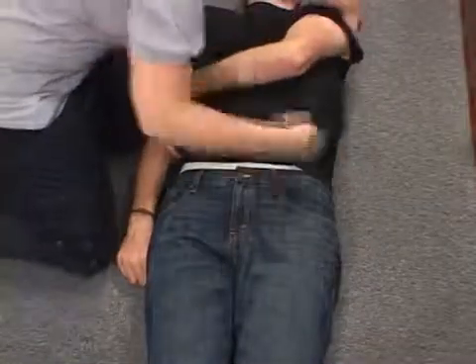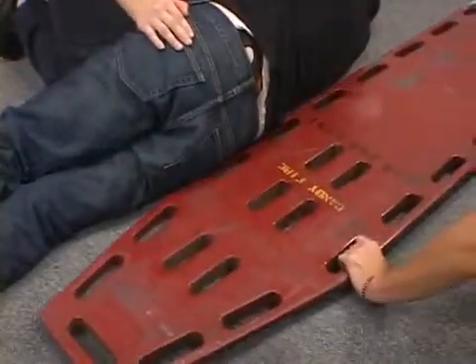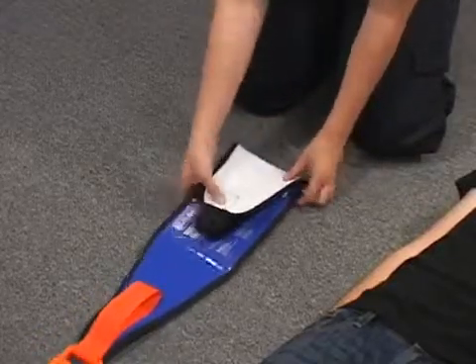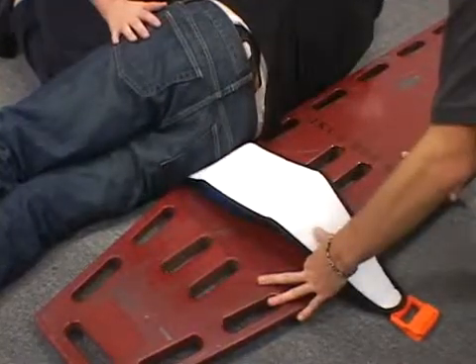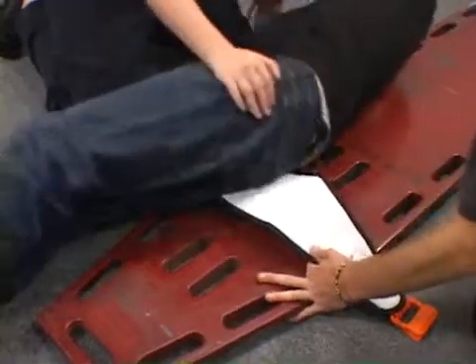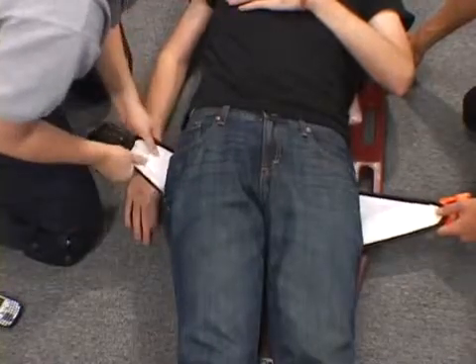If not lying on one side, gently log roll the patient onto the least affected side. Place the backboard with the distal end at the level of the patient's knees. Create an accordion fold in the end of the sling opposite the buckle side. Place the sling with the accordion fold on the backboard at the estimated trochanteric level. With the backboard pressed tightly against the patient, gently roll the patient onto the backboard and pelvic sling, then reach beneath the patient and pull out the end of the accordion flap.